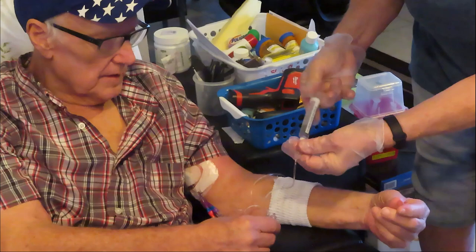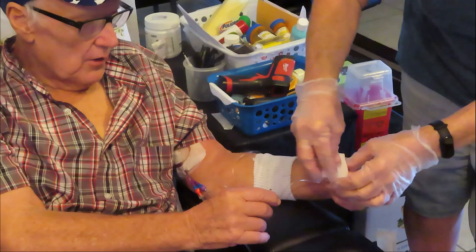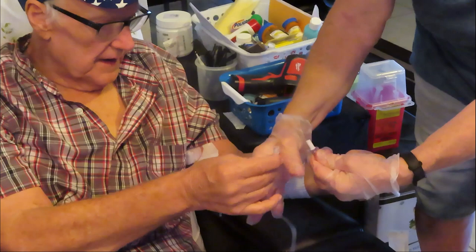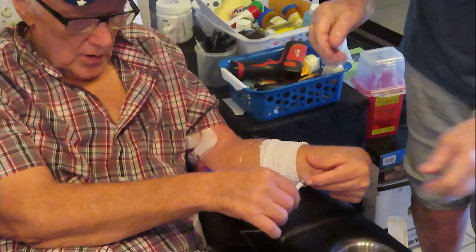Take that end off. Now she's going to clean the end off one more time. We use a lot of these pads. This is how I was shown to do this. Now this end here gets screwed onto that end there. Okay, now we're all hooked up to this.